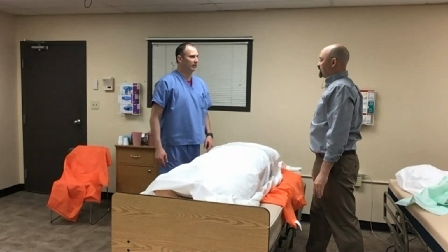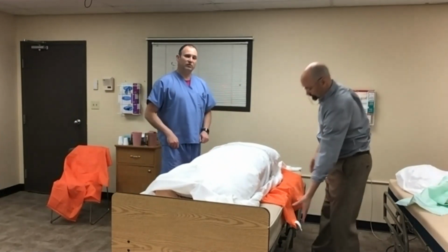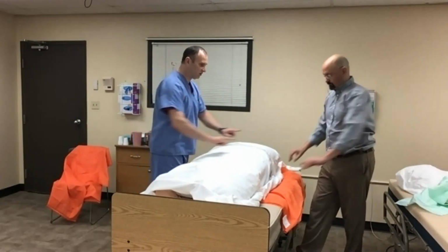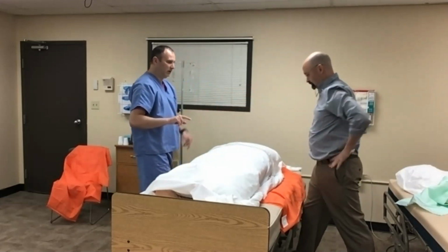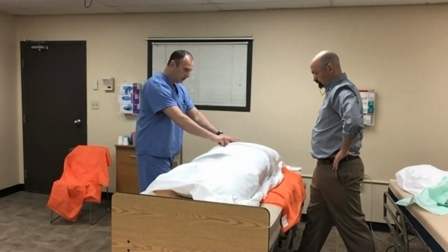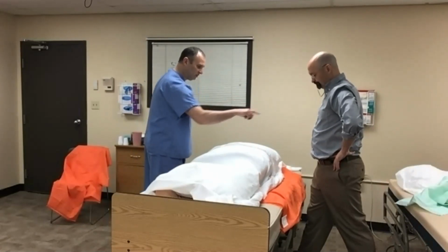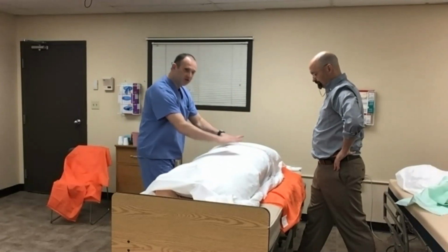Which way are we going to turn? So we're just showing that. Oh, I'm sorry. You're right. So the reason that we use 2 is so that when we complete the task, we're going to go toward Chris. So we were going to slide up and then over, okay? So we use the slide sheet to get me over. This one will roll that way as we use most of that one to get over toward Chris, and then we're using this one to get the patient over and finish the prone.